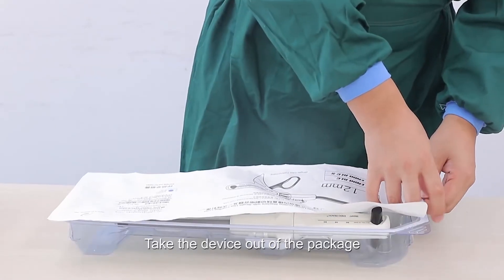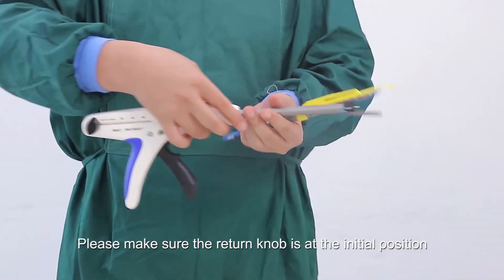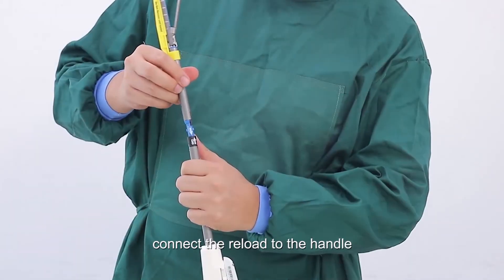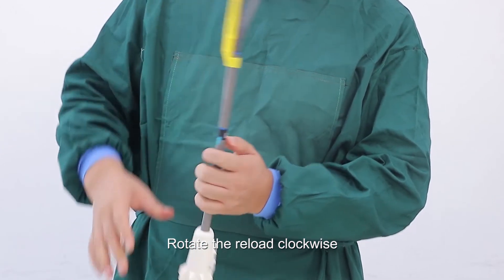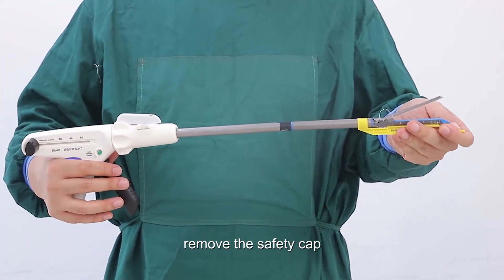Instructions for use. Take the device out of the package and check that it is in good condition. Make sure the return knob is at the initial position. By pulling the return knob all the way back, connect the reload to the handle, aligning arrow to arrow. Rotate the reload clockwise to fully connect it into the stapler shaft. After loading the reload, remove the safety cap.